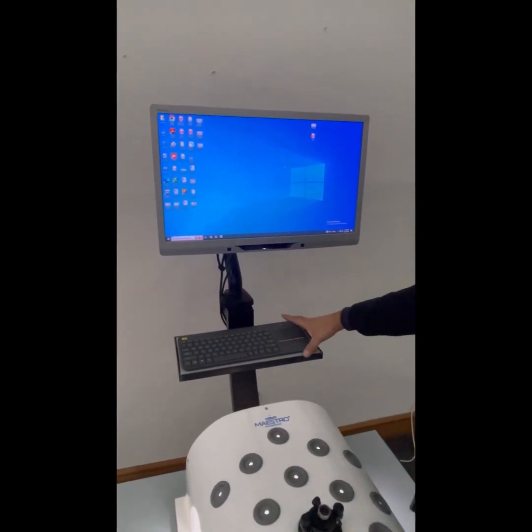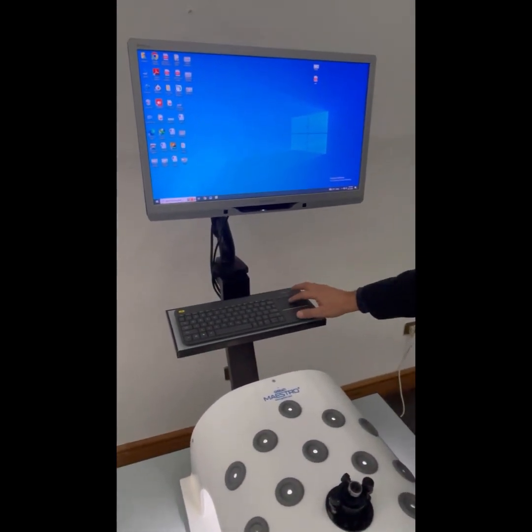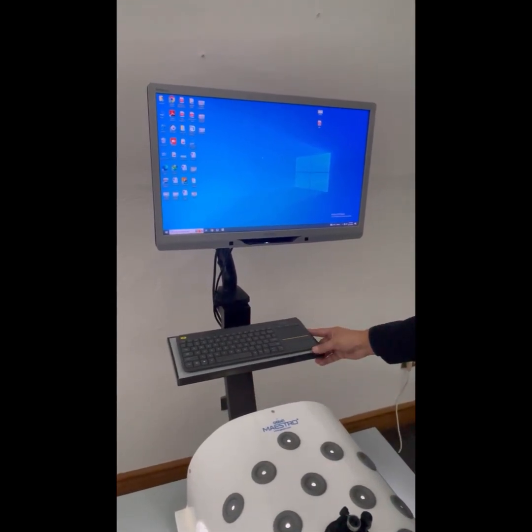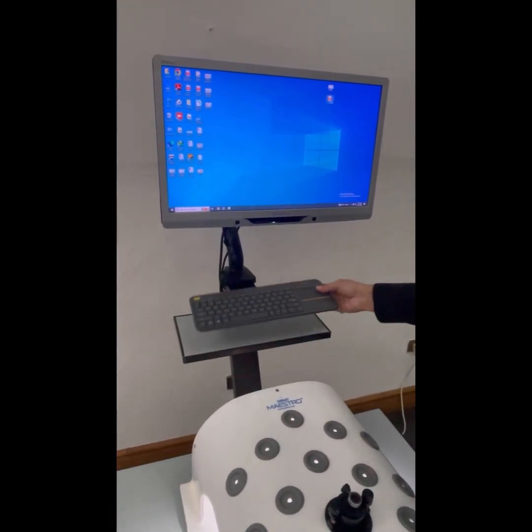We also have a smart keyboard fitted with a built-in trackpad. We have kept the size small so it looks nice and handy, and it is a Bluetooth keyboard so there are no wires attached.